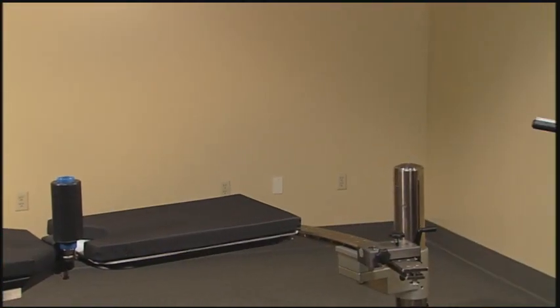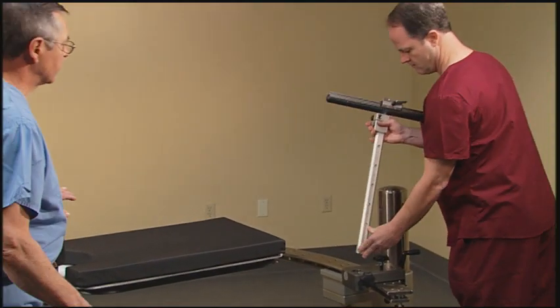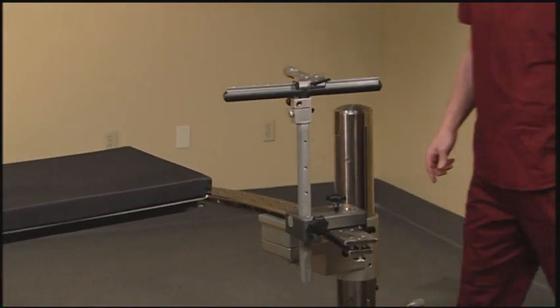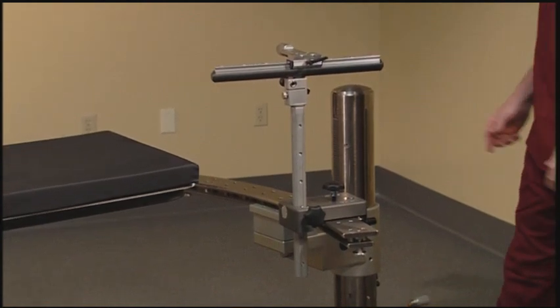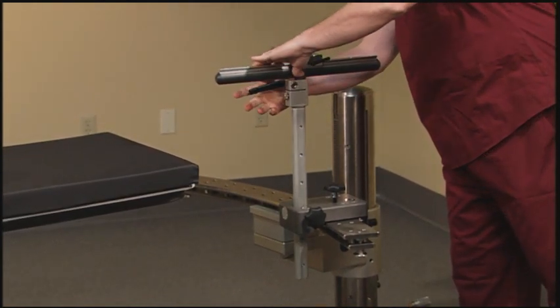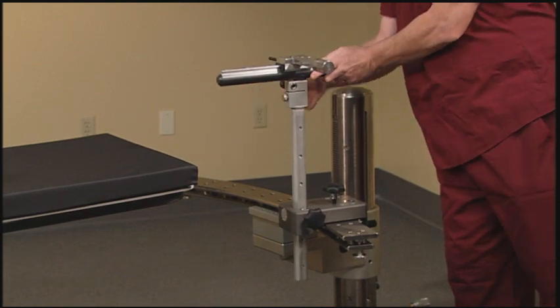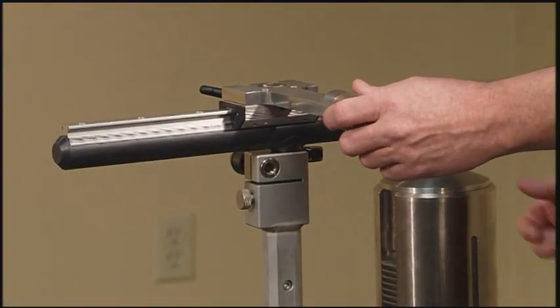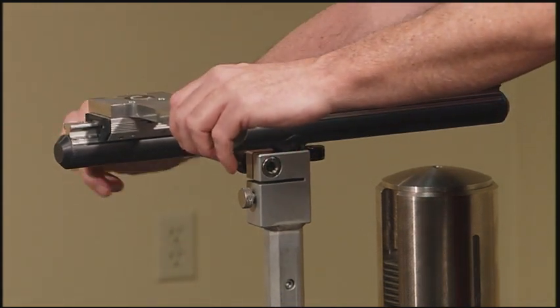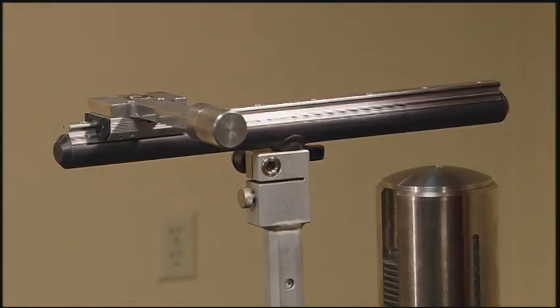Using the traction block at the foot end of the table, insert the vertical traction post. Then using the rotation, rotate the traction hammer to the outside of the table. It is important during traction that the hammer assembly be all the way proximal to the patient, which will allow for maximum traction during the procedure.